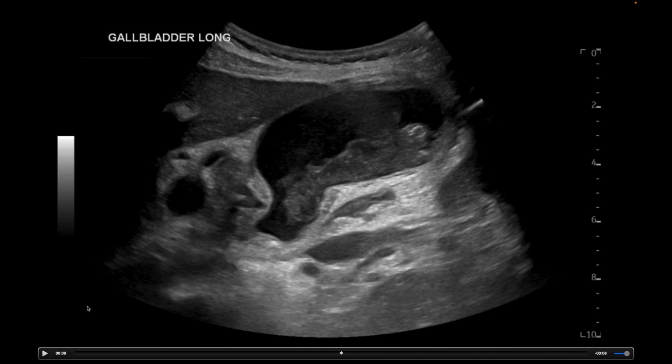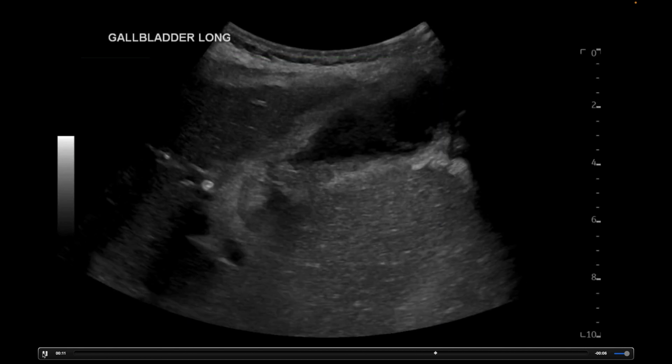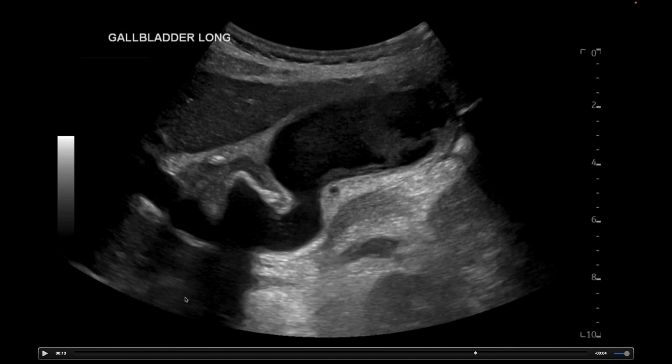And if I keep playing this video, you'll see that at the neck of the gallbladder there is actually right here a hyperechoic stone with a nice dense black shadow behind it. So this is the stone that you don't want to miss. Often we get distracted by seeing stones up here in the gallbladder, which, yep, it's good to know about them, they're there. You may see sludge, but this one is the stone you don't want to miss. This is the one causing all the problems, and this patient will need to have their gallbladder out pretty quickly, I imagine.